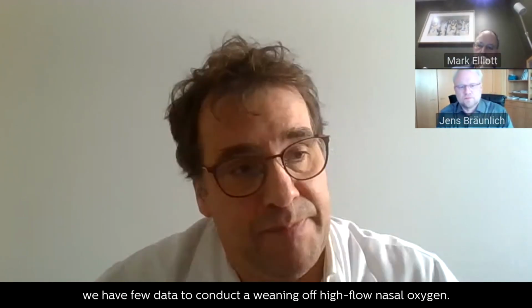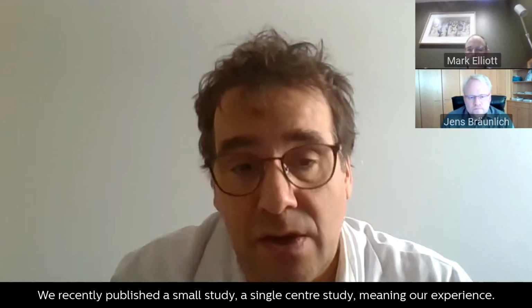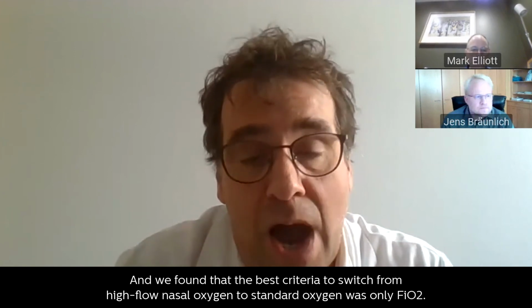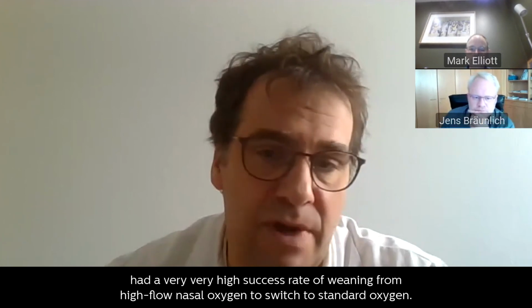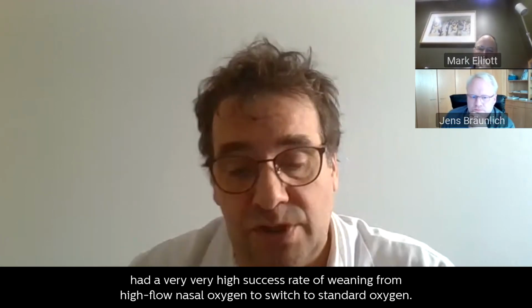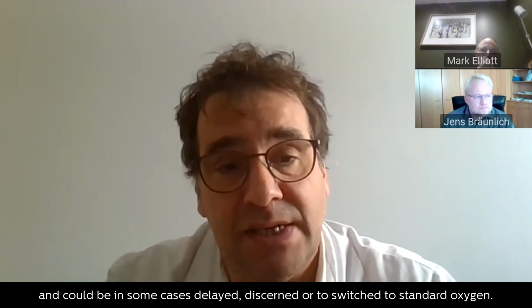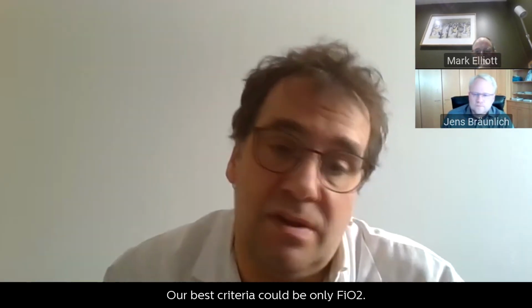By contrast, in case of patient improvement, we have few data on weaning high flow nasal oxygen. We recently published a small single-center study, meaning our experience, and we found that the best criterion to switch from high flow nasal oxygen to standard oxygen was only FiO2. Patients with FiO2 of 40% or below had a very high success rate of weaning from high flow nasal oxygen to standard oxygen. Because in this situation, high flow is low and could, in some cases, delay discharge. Our best criterion could be only FiO2.